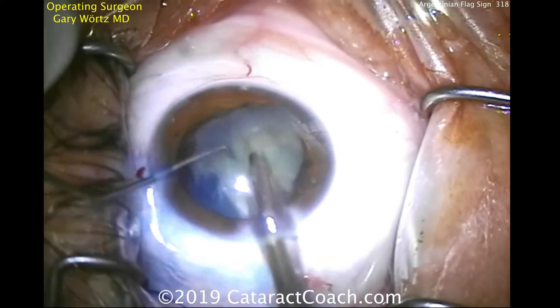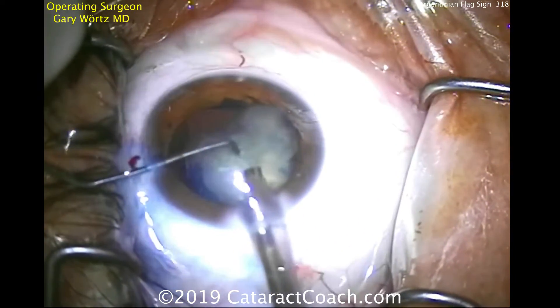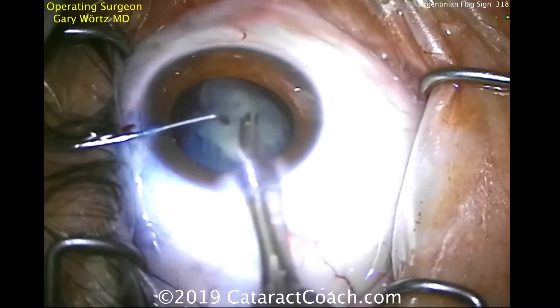Here's the second half of the nucleus. It can be chopped and brought up to the iris plane and phacoemulsified. The key here is to stay calm, stay focused, not skip a step, and just get through the rest of the case.